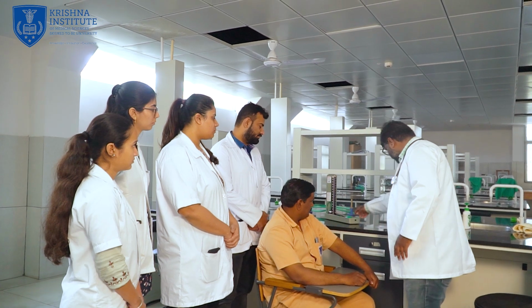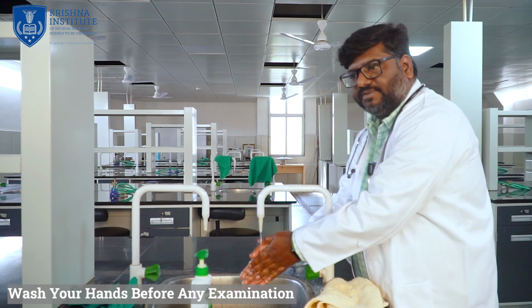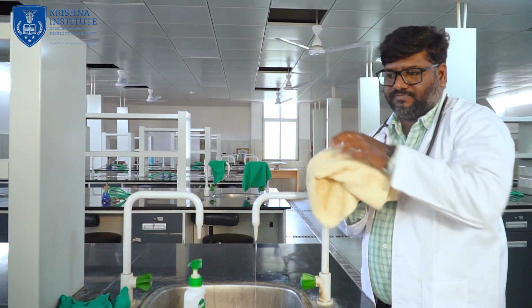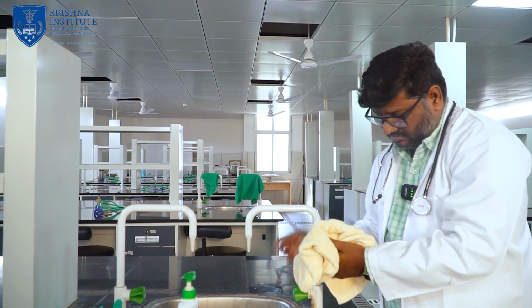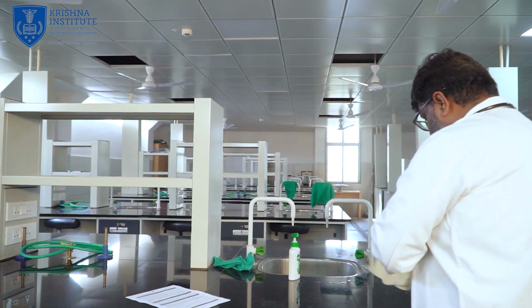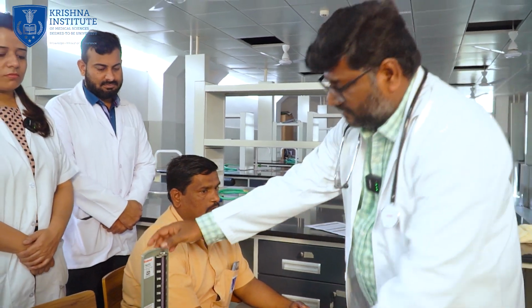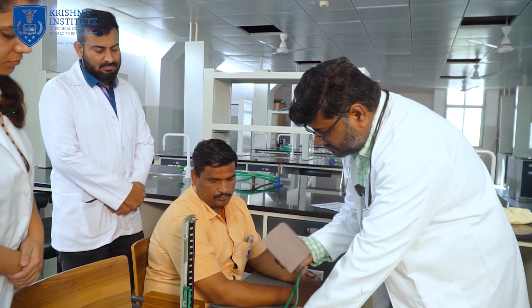Then, before going for any examination or blood pressure measurement, you're supposed to wash your hands. Then ensure that your apparatus is in a proper position.